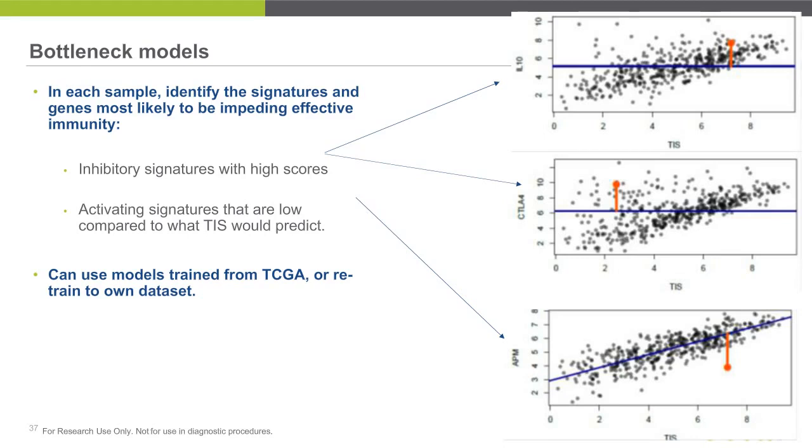So what seems to be happening in this sample, there's high immune activity, lots of T cells and CD8 T cells, cytotoxicity, interferon gamma signaling, but for some reason the antigen presentation machinery is just not keeping up with that. So it might be that the tumor has somehow downregulated that, downregulated B2M, for example, to try to evade immune detection. And this is the kind of barrier that is probably pretty hard to treat, and might make this an unpromising tumor to treat with immunotherapy despite its immune hot status.